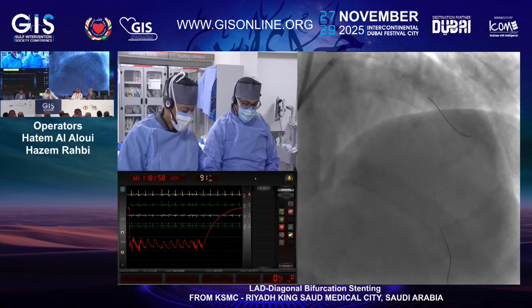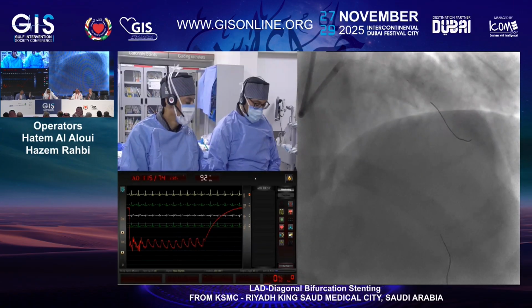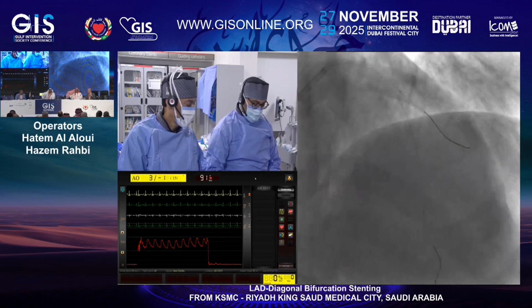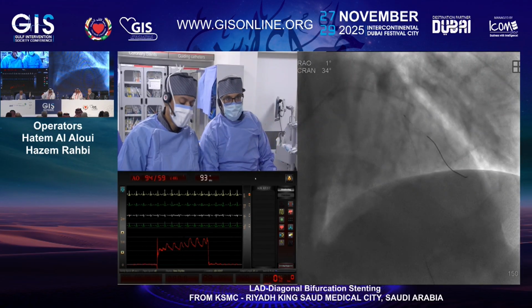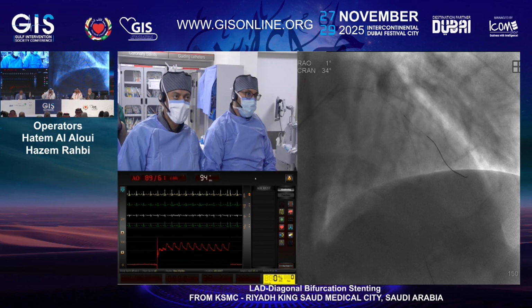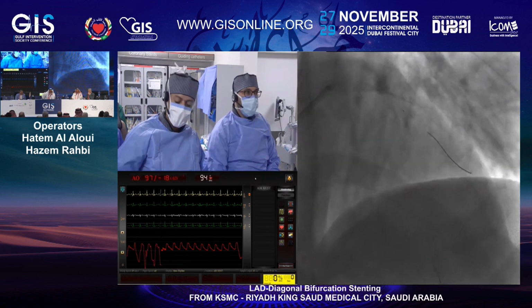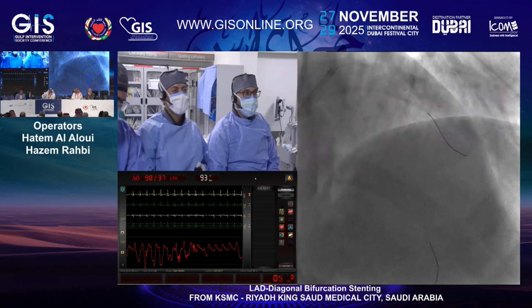Dr. Hatem, let me just understand your question. When you say short stent or long stent, you mean short stent across the diagonal or long stent back to the proximal LAD, the ostium actually? Absolutely, yes. So in both cases, you're going to stent across the diagonal. Yes.